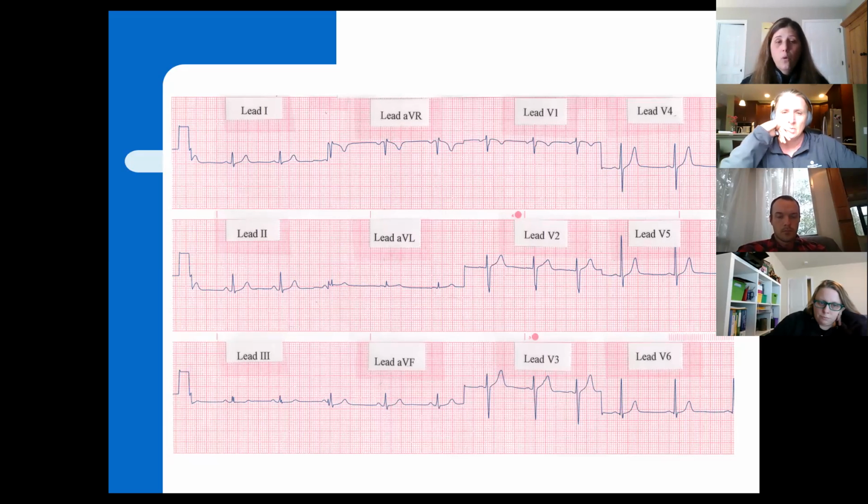So it's important that we have this for diagnostic purposes, because a doctor is going to look at several different leads off of the 12-lead EKG printout to make a diagnosis of whether they have a block, are they having a STEMI, are they having an NSTEMI. They're not going to look just at one lead alone and say, oh, there's an issue, okay?